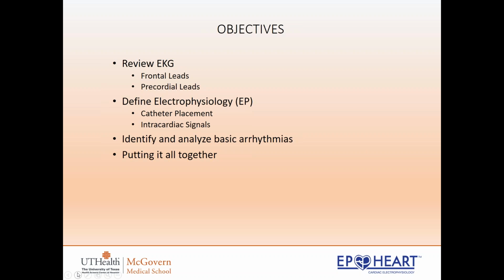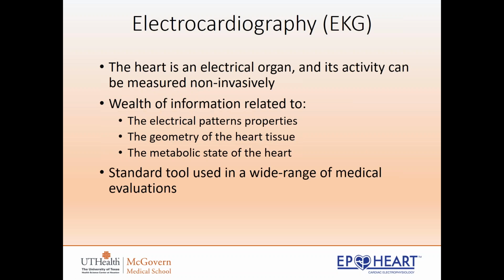So a little bit about the EKG. We all should be fairly familiar with it. It gives the physician a good understanding of what's currently going on and what has occurred in the past. The patient should be on an EKG for any kind of cardiac rehab or stress test. We know that. Looking at that, we can see the electrical pattern properties of what's going on. It also gives us the geometry of the heart tissue. It lets us know if there's an axis change or some sort of deviation, and the metabolic state of the heart at that particular moment in time. It's a wealth of information, and it's used in a wide range of non-invasive tests.